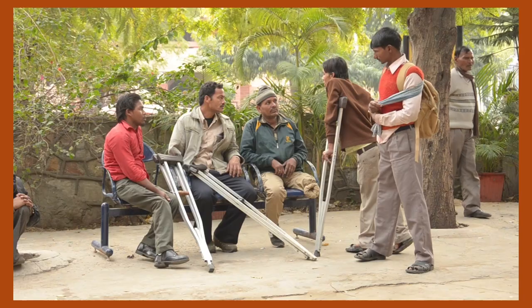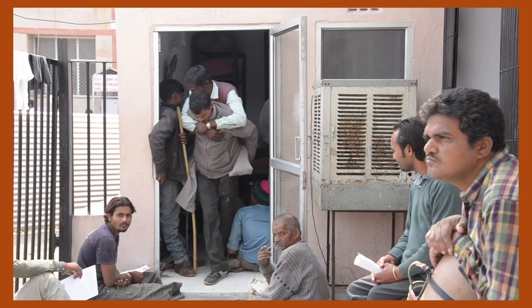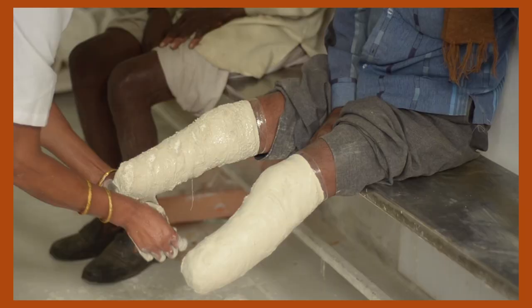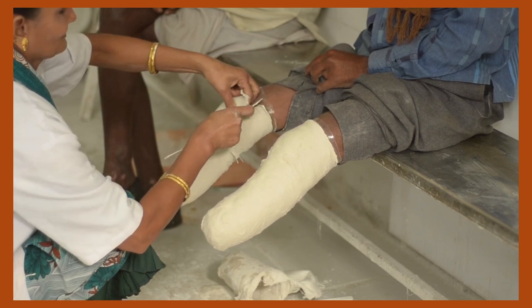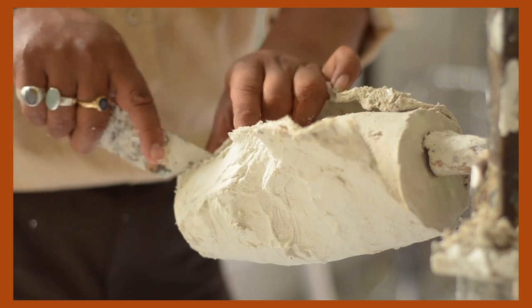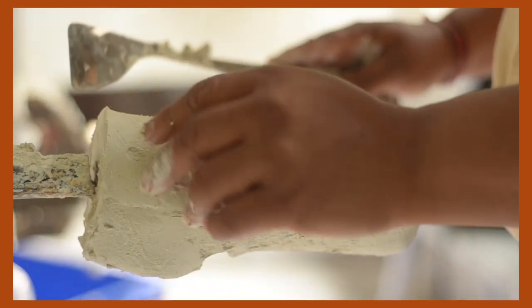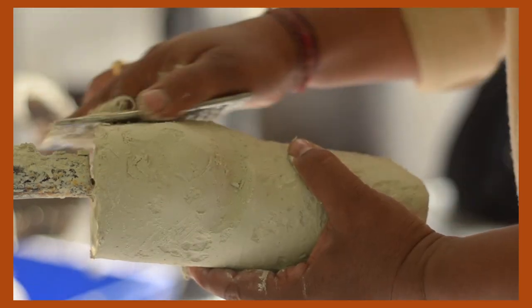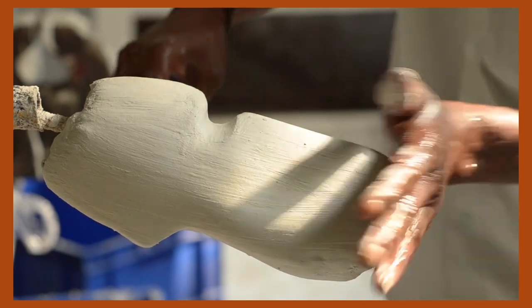This is the center in Jaipur. People come in one by one to take their cards. Then there is a very simple process of using a plaster cast to get the exact mapping of the stump. Then you make a male cast out of the female mold, and you have the stump — an exact replica — for your lower knee prosthesis.